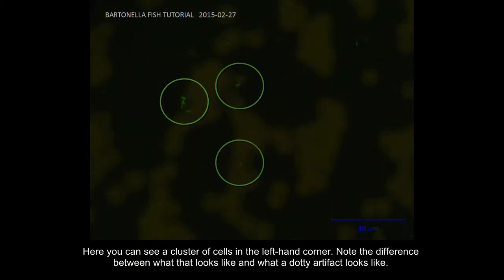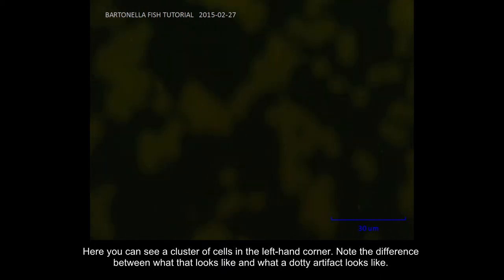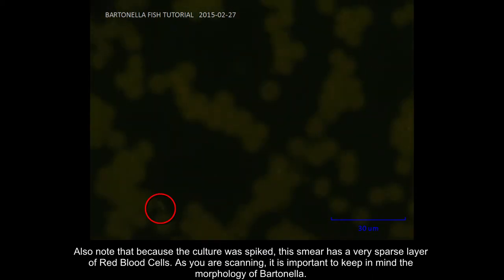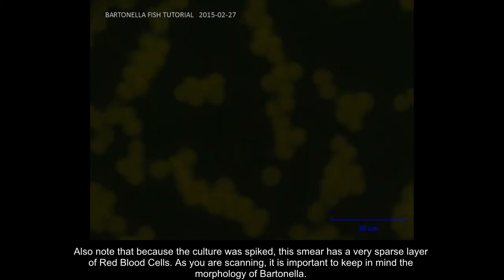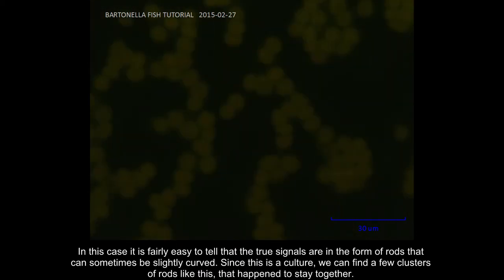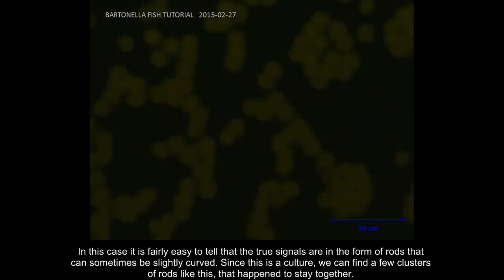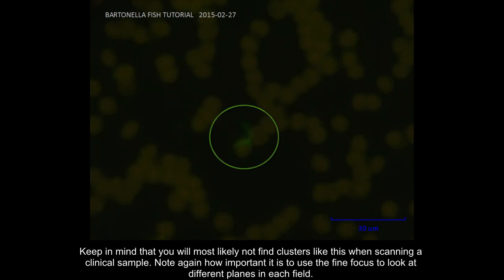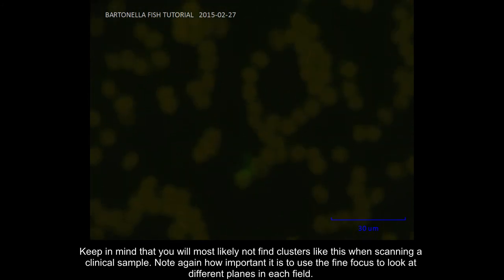Here you can see a cluster of cells in the left hand corner. Note the difference between what that looks like and what a dotty artifact looks like. Also note that because the culture was spiked, this smear has a very sparse layer of red blood cells. As you are scanning, it is important to keep in mind the morphology of Bartonella — in this case it is fairly easy to tell that the true signals are in the form of rods that can sometimes be slightly curved. Since this is a culture, we can find a few clusters of rods like this that happen to stay together.